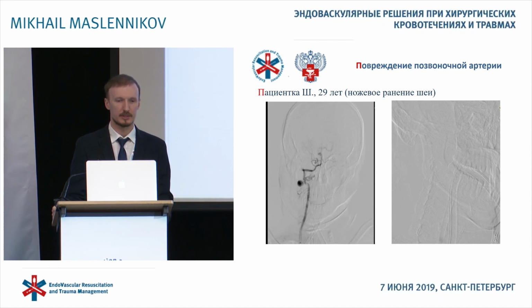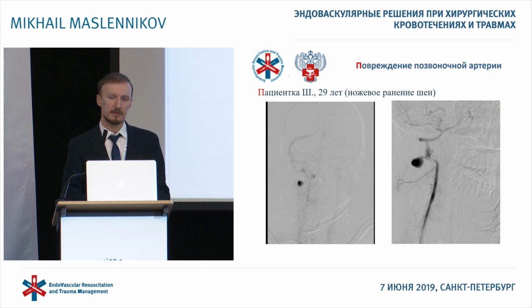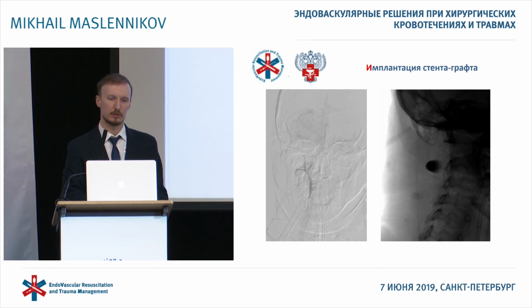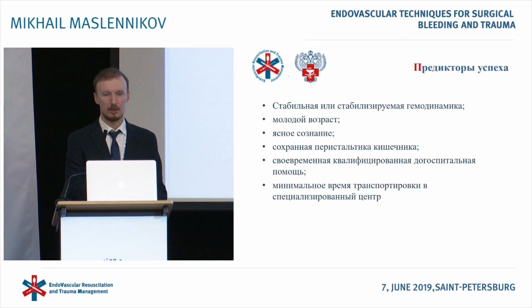One of our recent patients, a female, 29 years, had a stabbing wound of the neck. The wound was quite high, so it was unavailable for open surgery. We managed to eliminate it very quickly and efficiently endovascularly by implanting a stent graft. It was a very severe trauma. After 1 month she was discharged, but since it was a severe case, she spent almost 1 month in resuscitation.